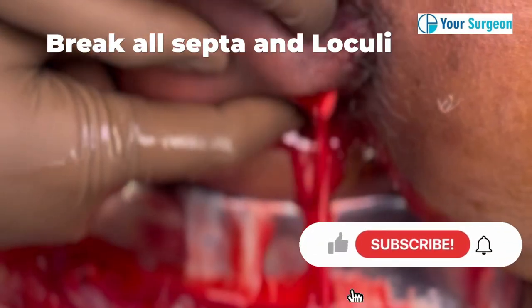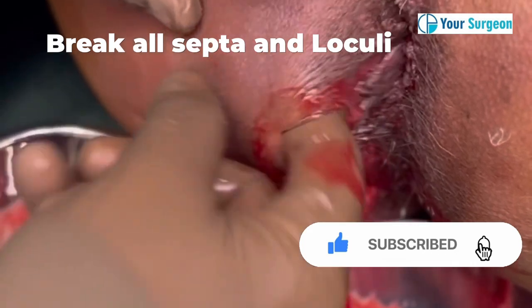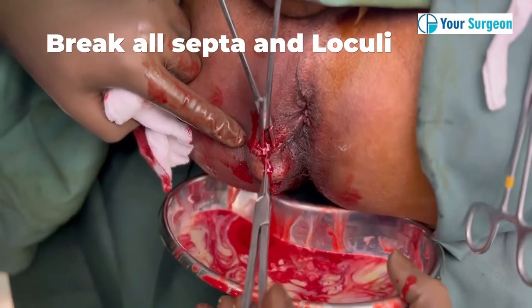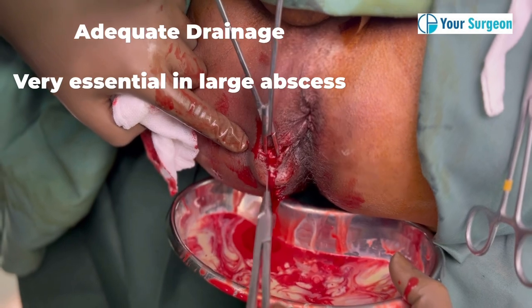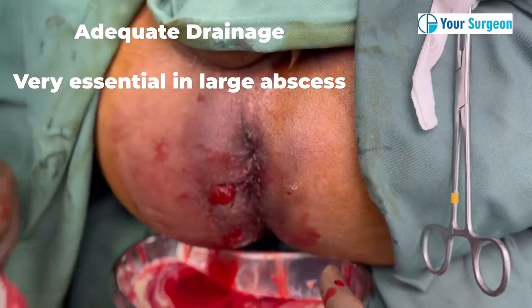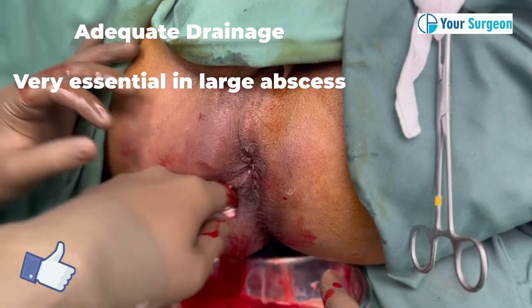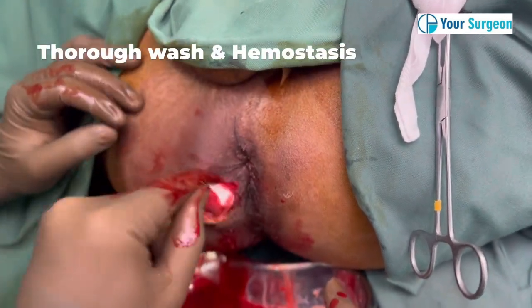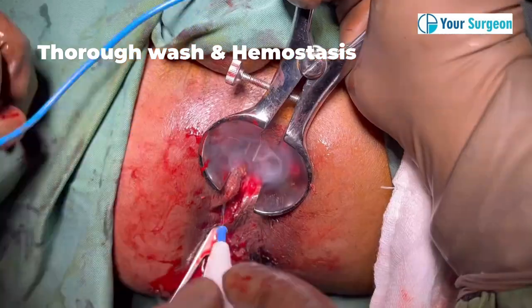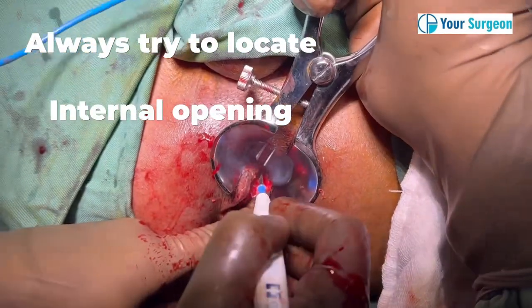All the abscess material and necrotic debris has been drained. We then try to break all the loculi and septa forming the abscess for complete drainage. Since the cavity is huge, we lay open some extra skin so that drainage is adequate and the chances of fistula formation are minimized.